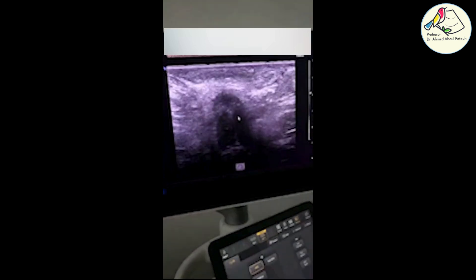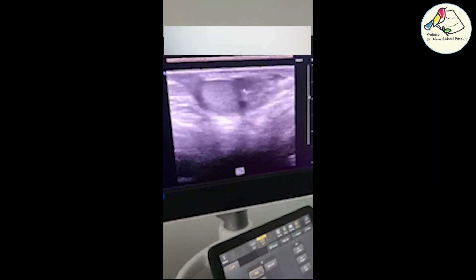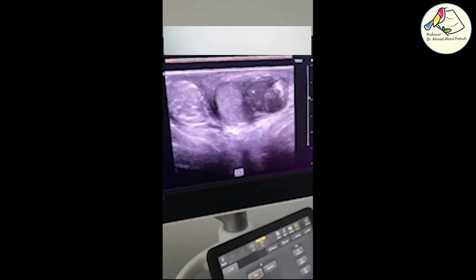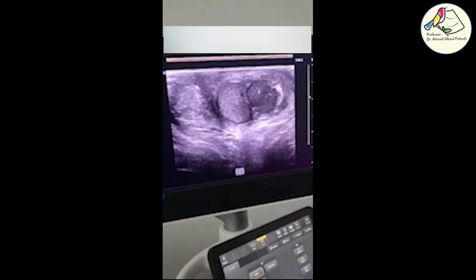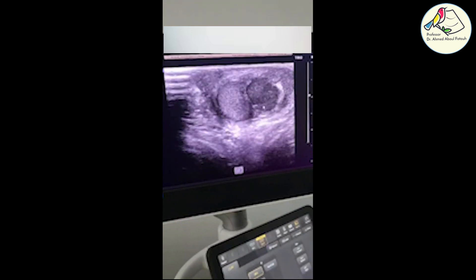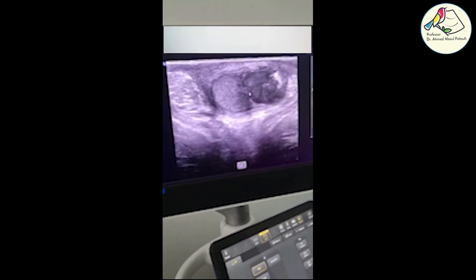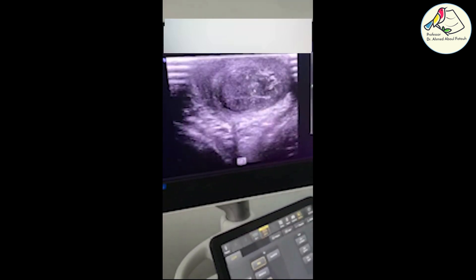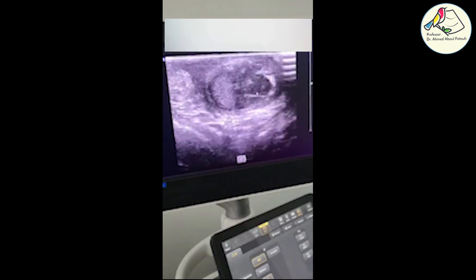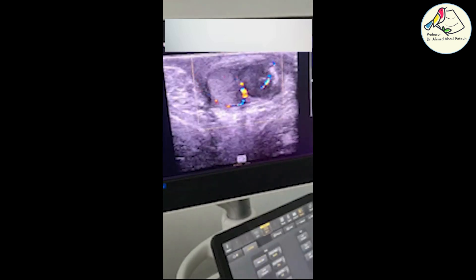We are examining in transverse. This is the corpora of the penis. Here is the left side — this is the left testicle — and this looks like a hematoma within the hilum. We will check whether it is intratesticular or not. This is a transverse scan and we will apply color Doppler here.